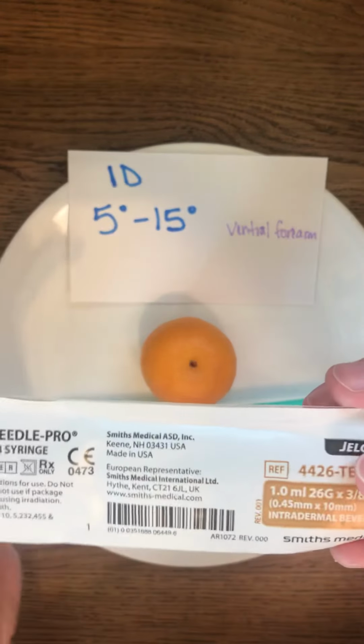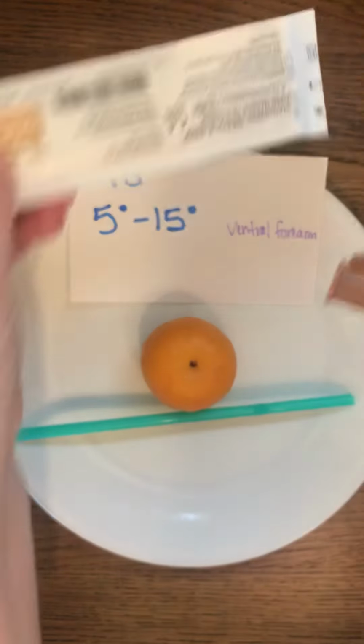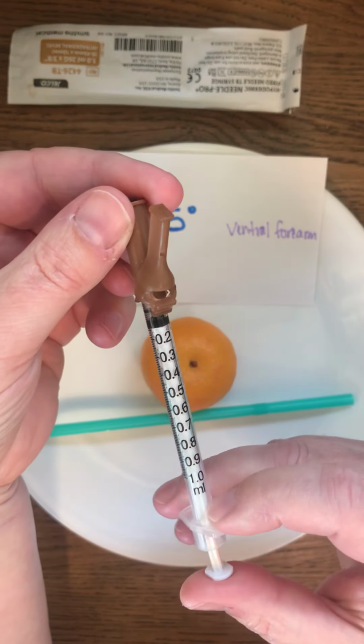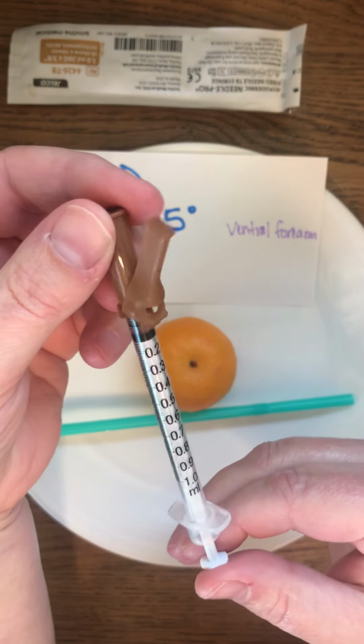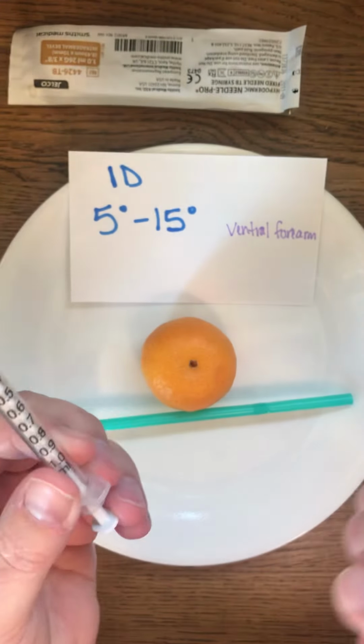As you are opening up your syringe, you can see that this is a very small amount. We don't typically administer any more than 0.1 milliliters of solution in the intradermal, so you don't need a very large syringe.